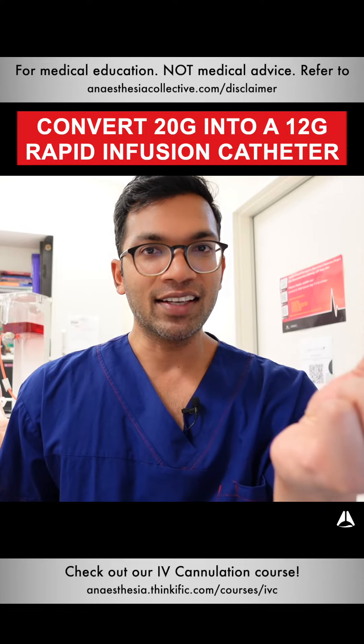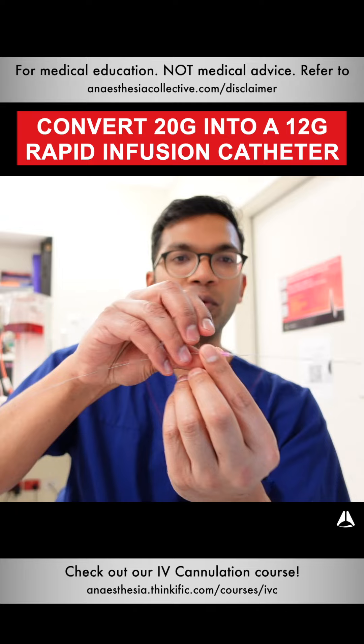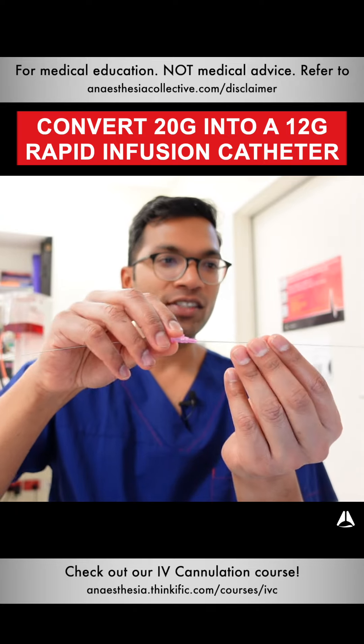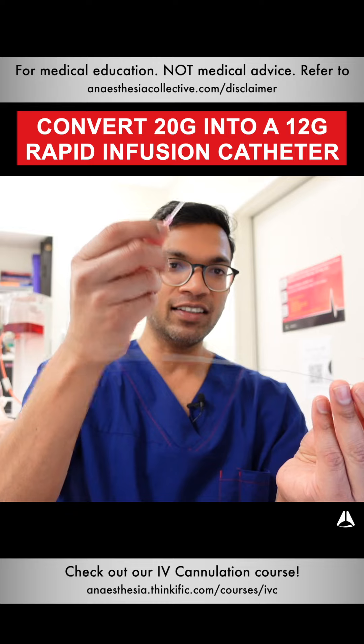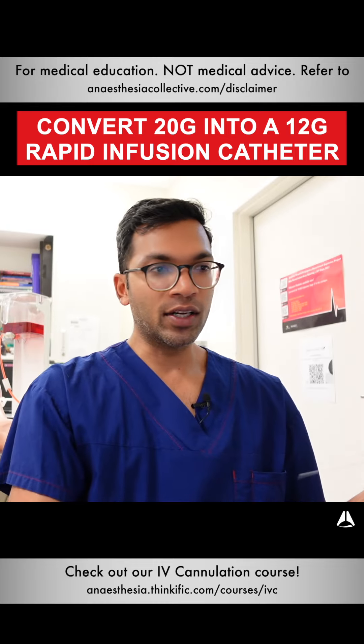The cannula is in the patient. I thread the wire — this wire is going to be inside the patient's thick vein. I take the cannula out, so now I've got a wire going through the skin into the vein. I remove the 20 gauge as mentioned.